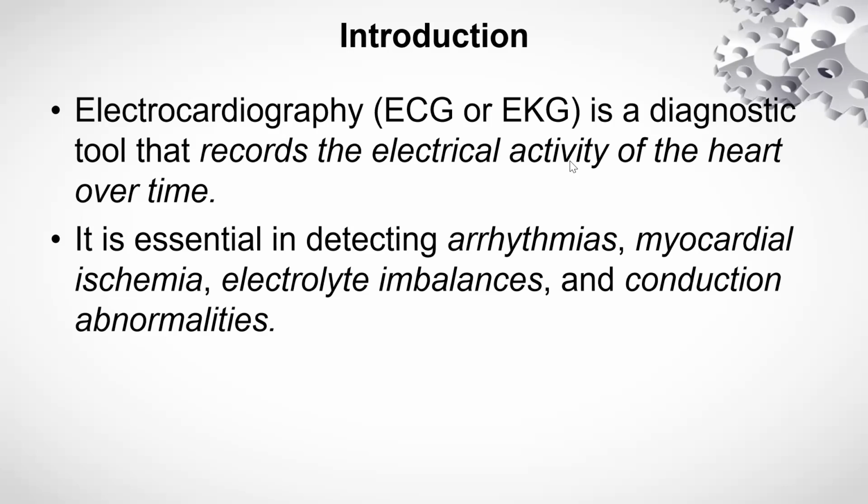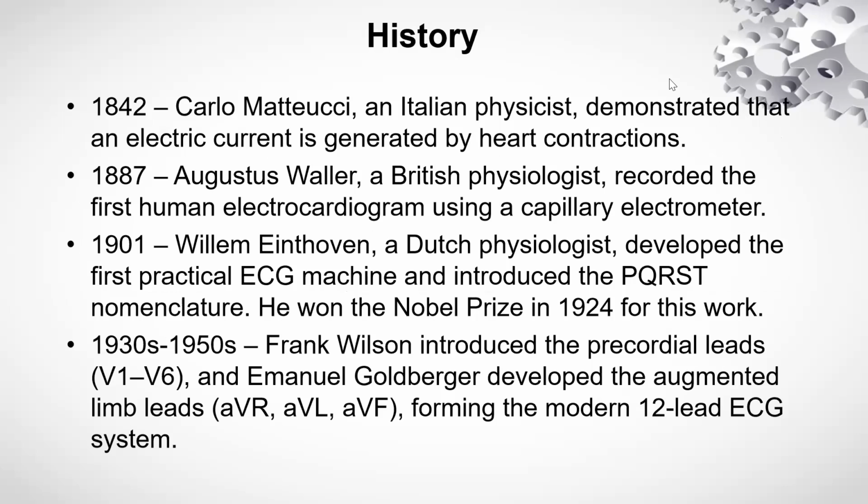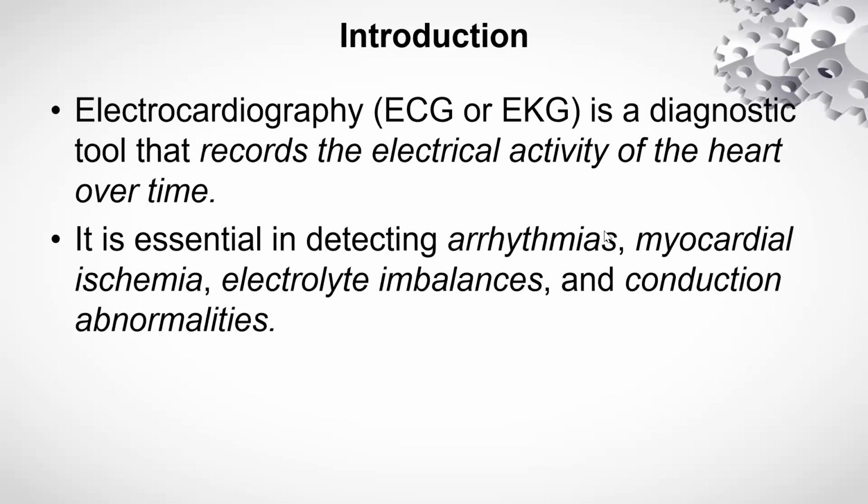So by way of introduction, electrocardiography is a diagnostic tool that helps to record the electrical activity of the heart over a period of time.